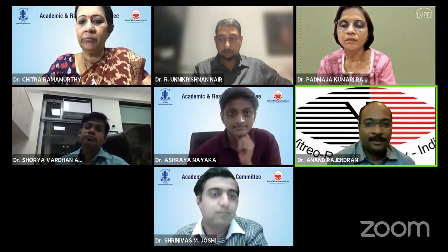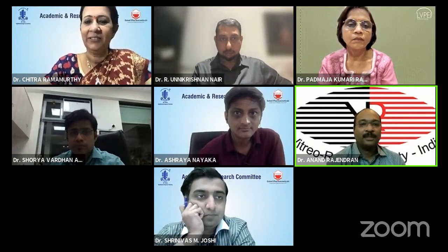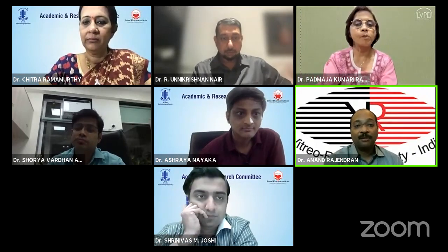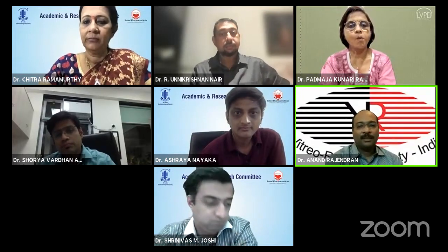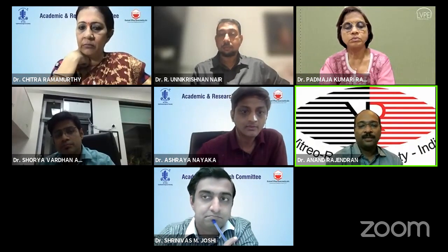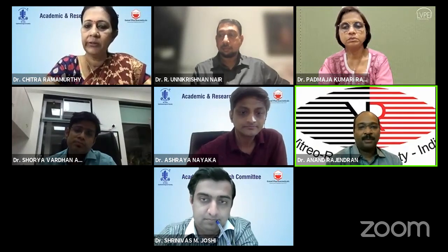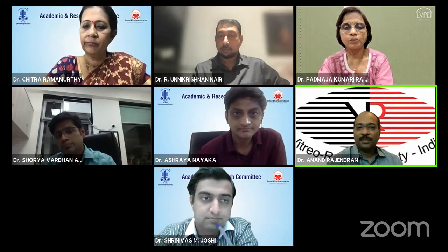Specific to this talk, excellent, very elaborate talk. Focal choroidal excavation, we've seen in a host of pathologies, and you touched upon a good number. It's part of the pachychoroid spectrum, an accepted aspect. The one thing we need to understand is that when you see that cavity, a lot of you should not jump the gun and think it's fluid that needs to be treated with repetitive anti-VEGF therapy. It's part of the pachychoroid spectrum. That's the only aside, but otherwise, I think you covered those things well.